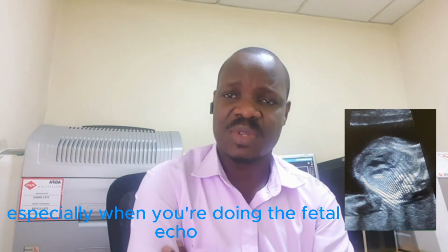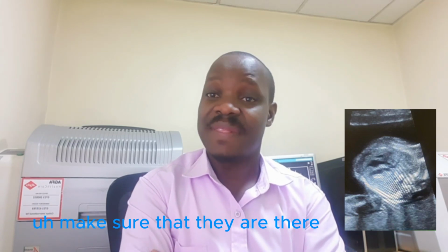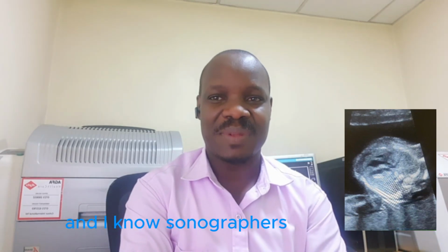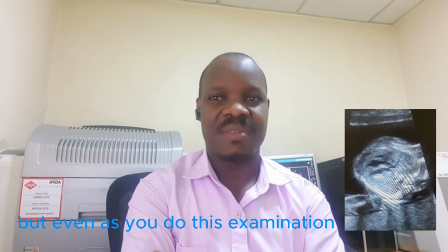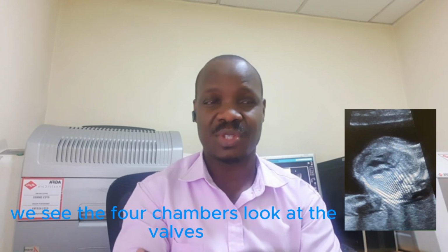Especially when you're doing the fetal echo, let's make sure you look at the 4 chambers, make sure that they are there. I've done scans for so many years, and I know sonographers will just want to look at the fetal movement, just want to look at the fetal heart, and the examination stops there. But even as you do this examination, especially normal scanning, make sure you do the 4 chambers. We see the 4 chambers.